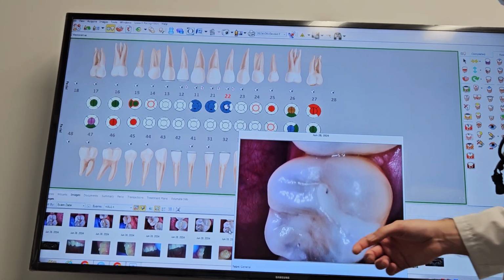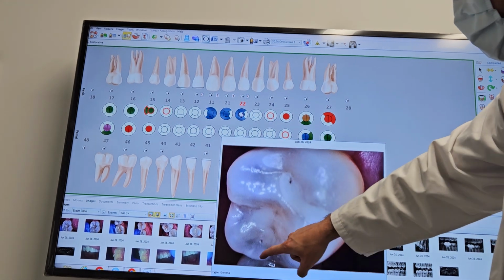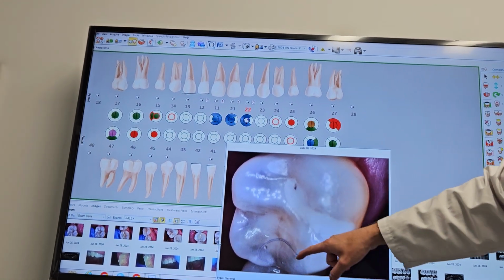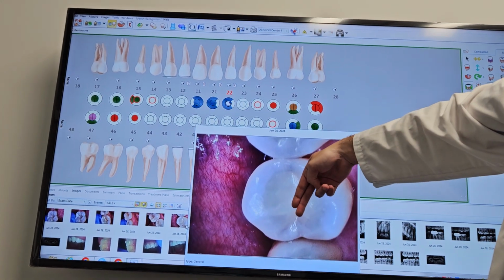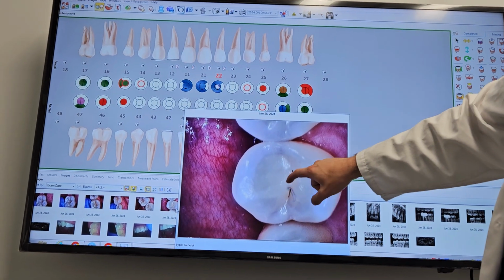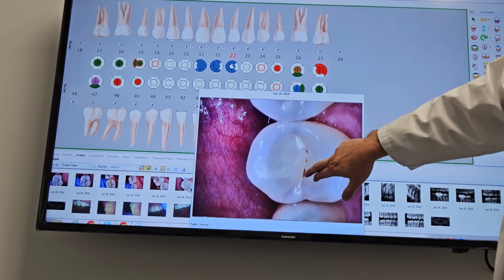I got you. Okay. So we'll show you over here. Same thing. It's just a little bit of maintenance here. And again, I'm cheating this darkness here. I can see it on the X-ray. Is that the same tooth or a new tooth? Same tooth. And then there's this guy here again, right? Healthy tooth, not so healthy, starting to form. And there are old fillings here that are just starting to get decay.